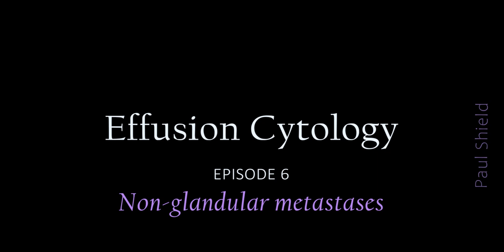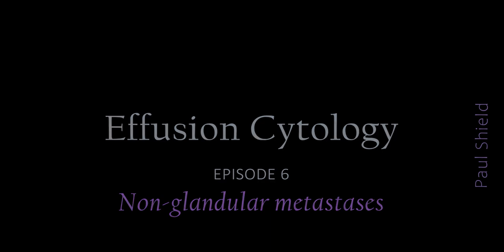So not adenocarcinoma. Adenocarcinomas make up about 80% of malignancies in effusions, but there are a whole range of other things. We're just going to look at 3 of those, and the first of these is metastatic melanoma.